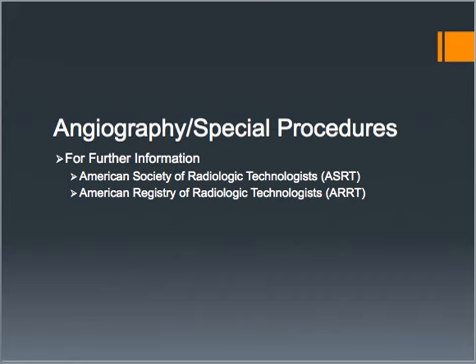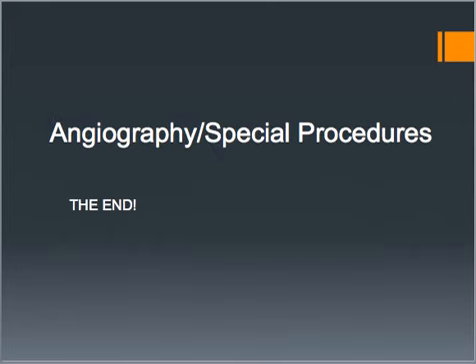So that's it for the images. You can visit the websites if you want to get more information on them. And I believe there's a couple videos on JetNet as well, if you want to see those. I think one's on pediatric angiography.